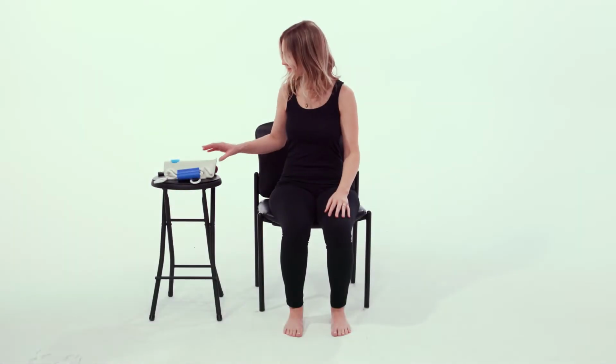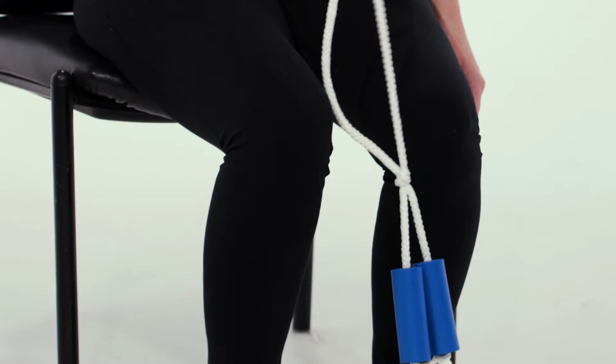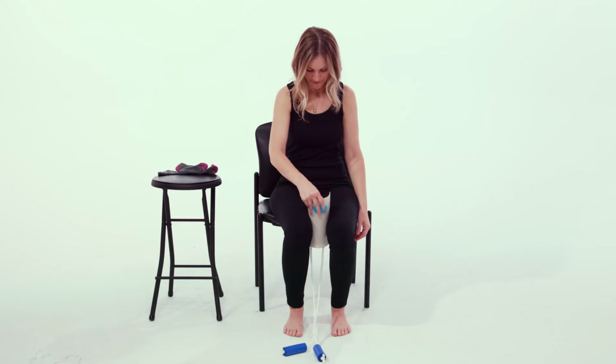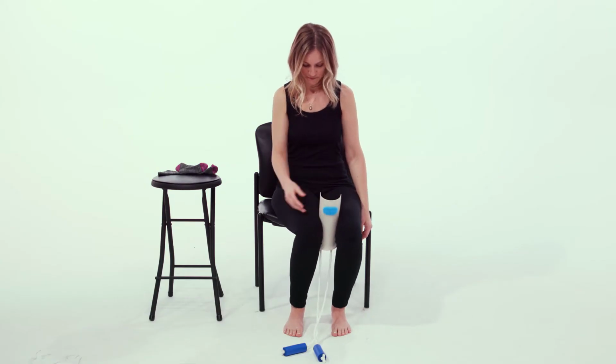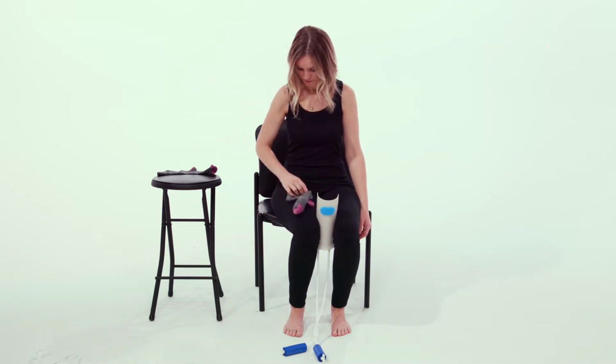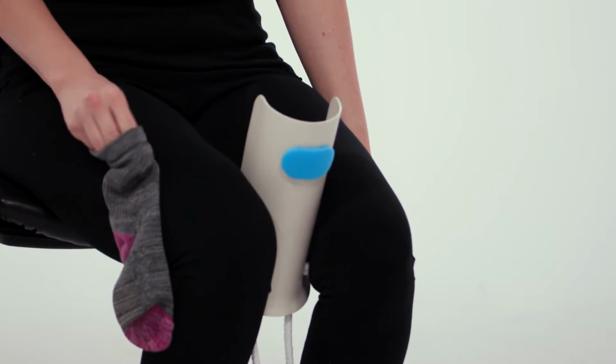To start, you can take both ropes and tie them together at the end to create a loop. Stabilize the sock aid between both legs. Have the end with the rope attachment on the bottom and the base of the trough furthest away from you.